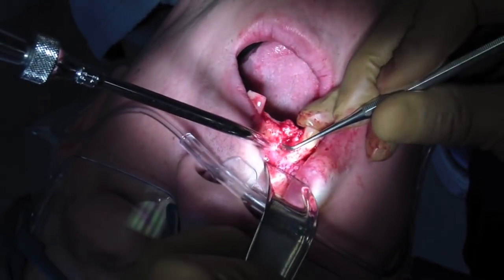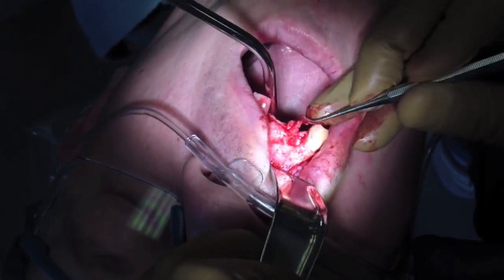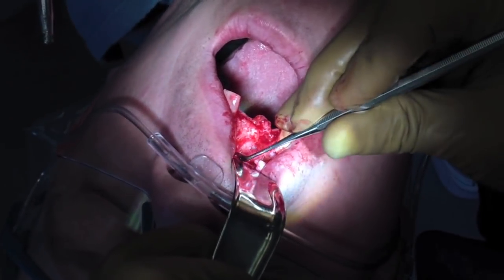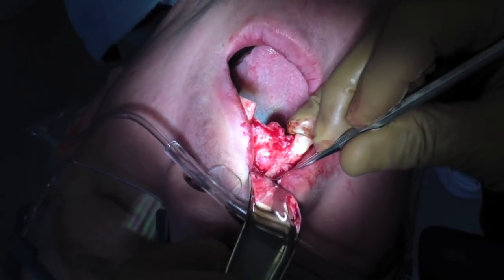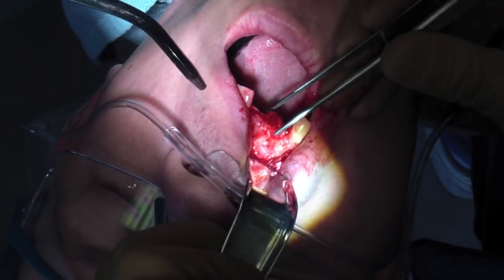One of the main instruments that you'll be using is a Woodson periosteal elevator. Those are classics. The Woodson's a really nice instrument — you can be fairly delicate. Be careful with your soft tissue. The less trauma, the faster it heals.